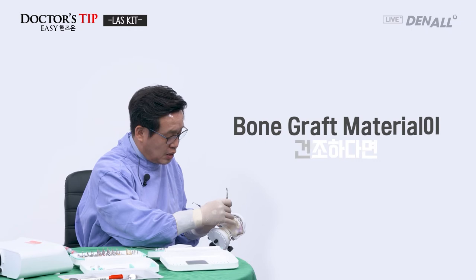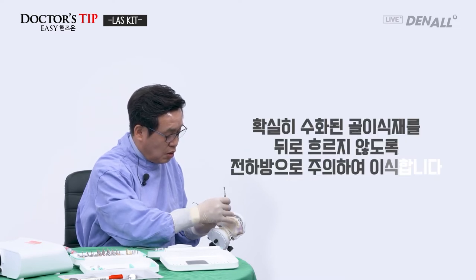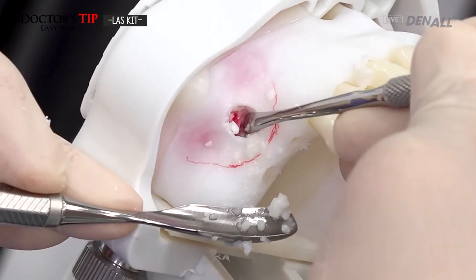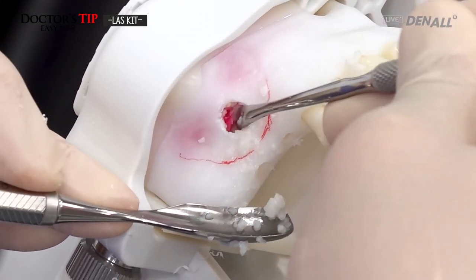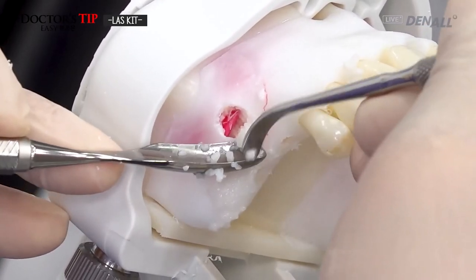And if the material is dry, then while doing grafting, if it comes in touch with saliva, biofilm can be formed and contaminated, resulting in infection. So like this, use hydrated bone graft material, and don't push it too much toward the back. Be cautious about that in doing the grafting. So make sure it doesn't go too much toward the back.